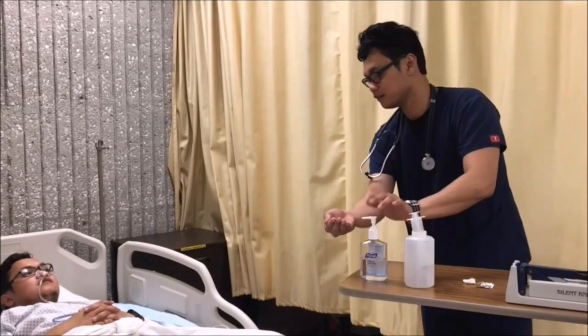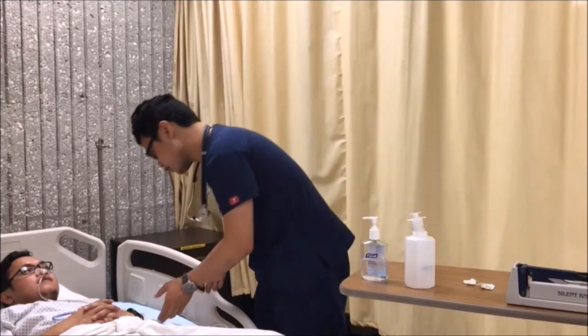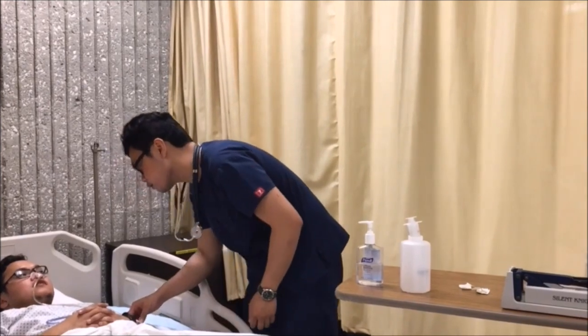Knock-knock. Hello, sir. Hello. My name is Ben. I'll be your nurse for tonight, okay? Could you tell me your name, please? My name is Don Catalim. And can you tell me your date of birth? 7-26-1988.